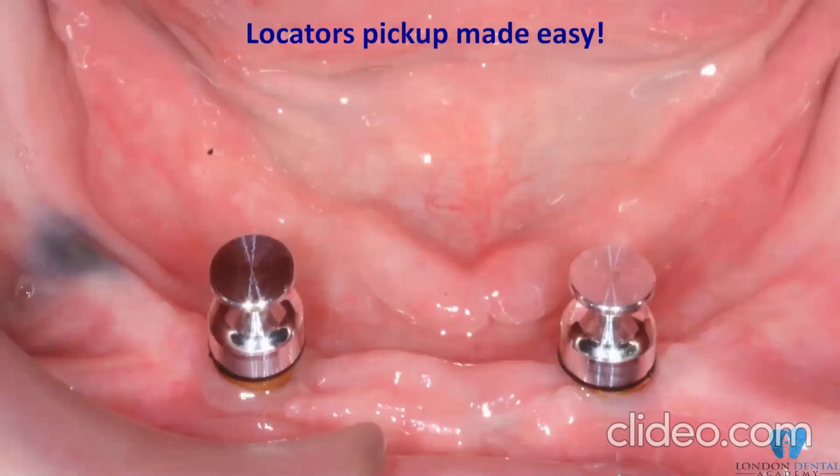For those of you who are doing locator abutments, as you know, it's quite simple and straightforward. It doesn't need any special arrangements. You have what we call the locator pickups. They are a closed tray type of pickup. Some of them, as you can see, come in different shapes.